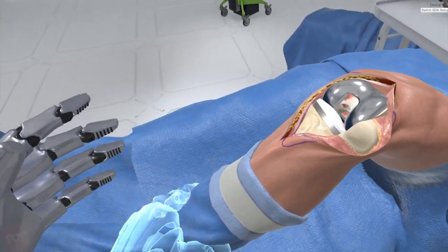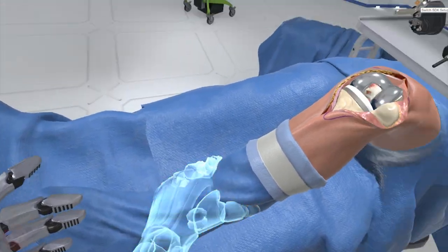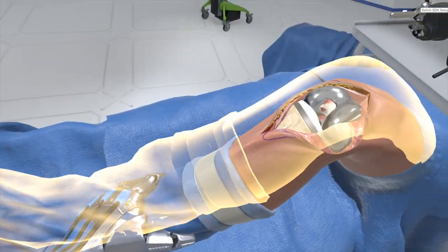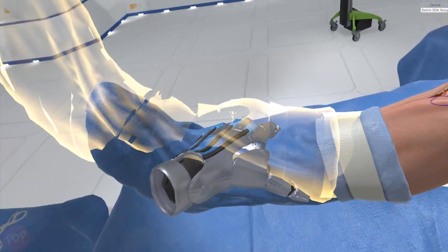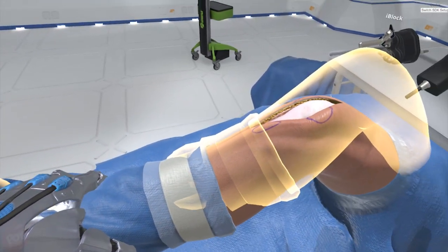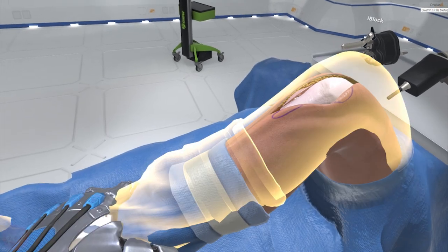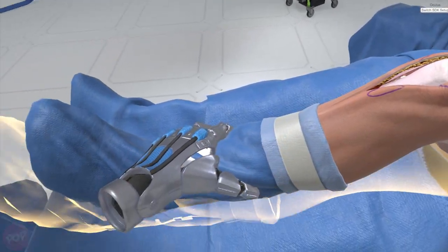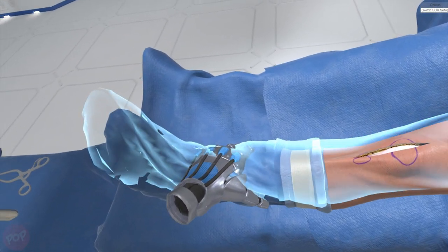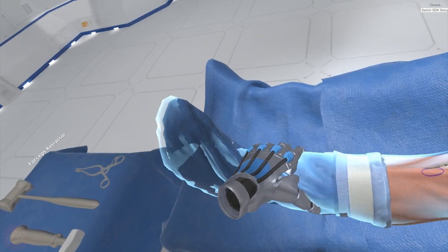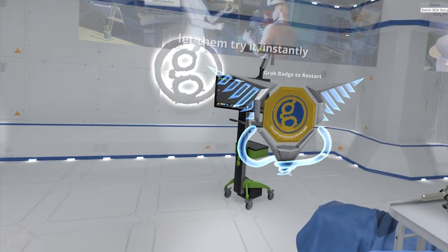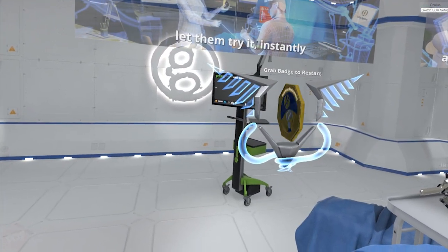Now run the final range of motion test. Congratulations, you have earned the total knee badge.